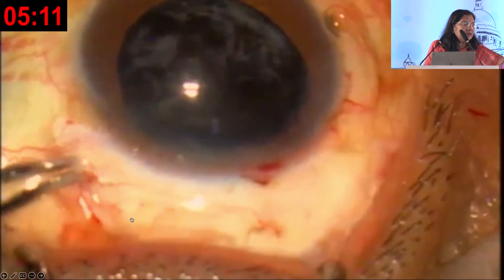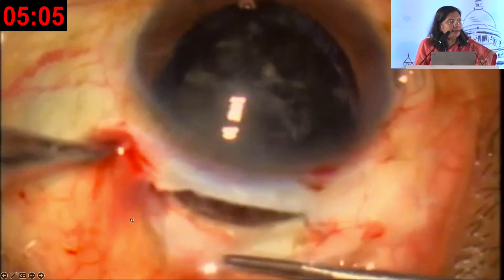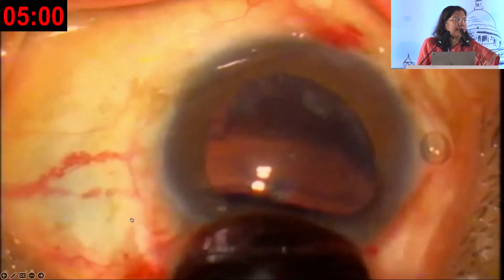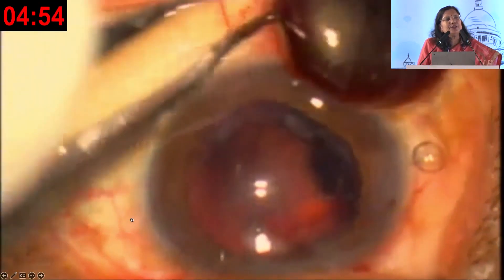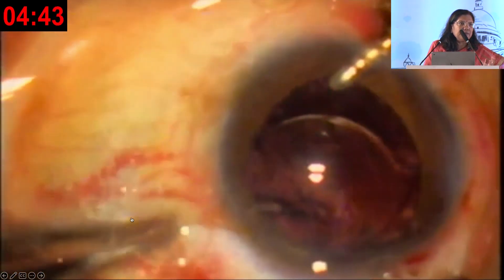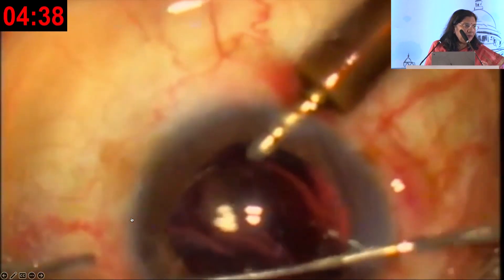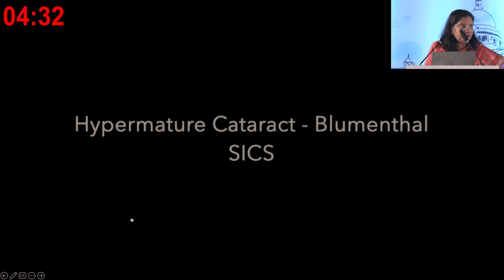This is a proper cataracta nigra and I would 100 percent not do phacoemulsification in these patients — and I never have. The patient was able to see a little bit for near, so they waited a long time before coming. The nucleus is so safely being removed and the IOL is being placed. This patient has got a new lease of life by seeing again after so many years. This is a safe, reproducible technique that can be done by anybody, and even this incision does not require suturing.